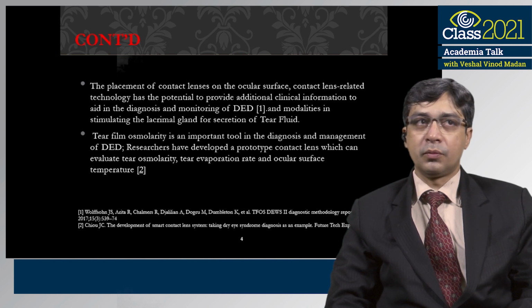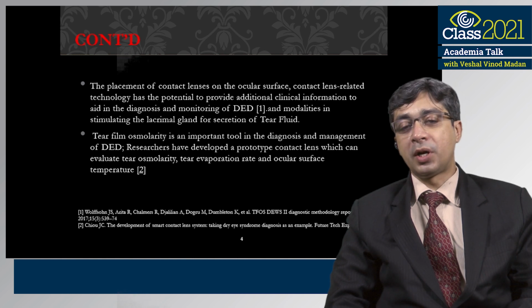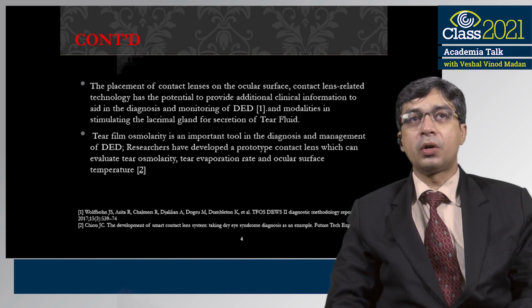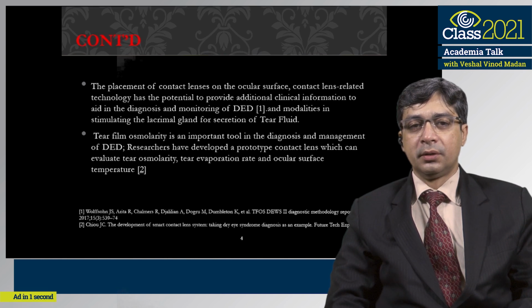Tear film and its properties, such as osmolarity, are an important tool in the diagnosis and management of dry eye disease. Researchers have developed a prototype contact lens which can evaluate the osmolarity, tear evaporation rate, and ocular surface temperature, which all together aid in diagnosing dry eye disease.